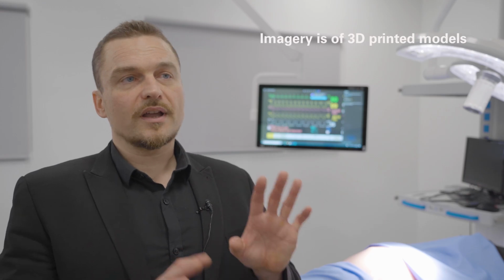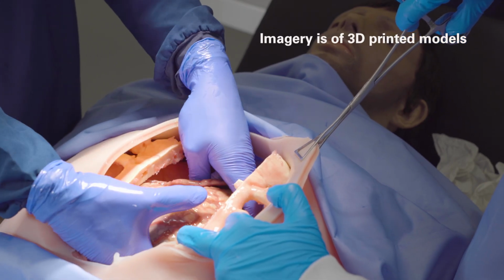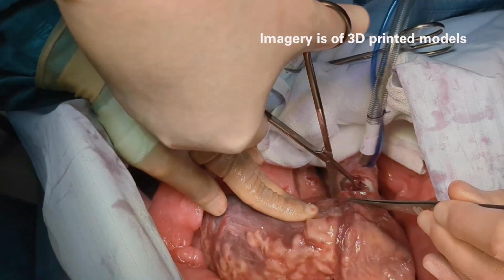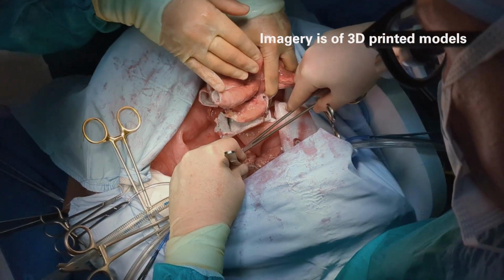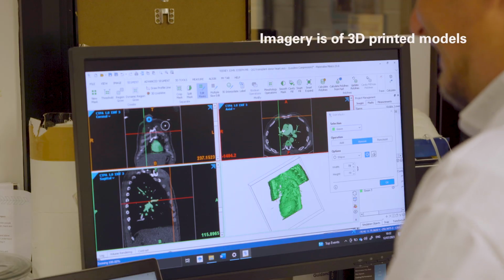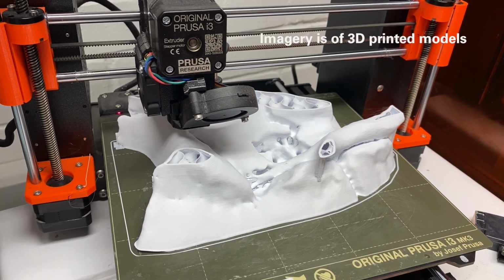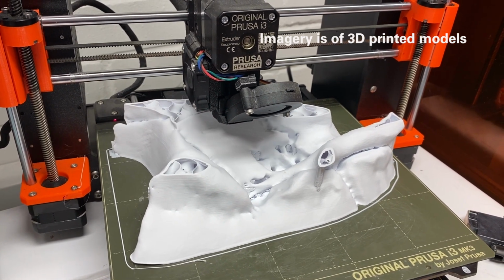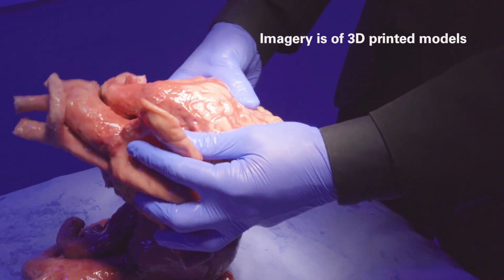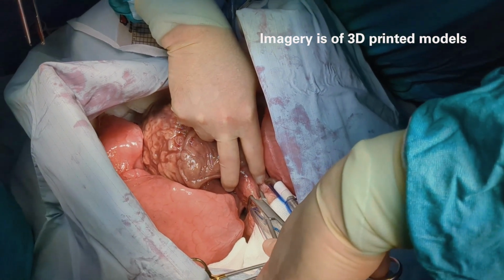The idea is that we have the diseased heart and lungs inside a simulated patient, and then the surgeon is able to cut out the diseased heart and stitch in the new heart exactly how they would in the real surgery. We use CT data from real patients and 3D print the components we need, and then change those rigid 3D prints into something which is soft and feels just like the real heart, looks like the real heart, and performs like the real heart when they're making incisions in surgery.